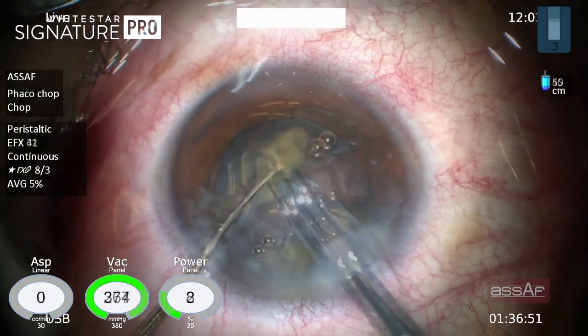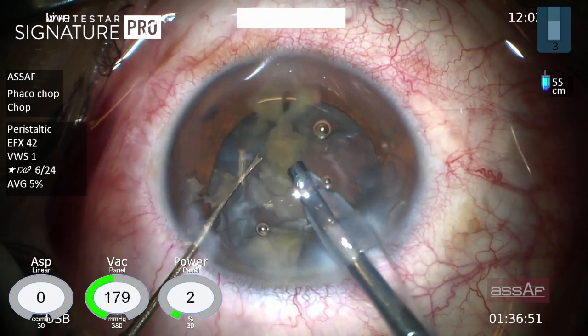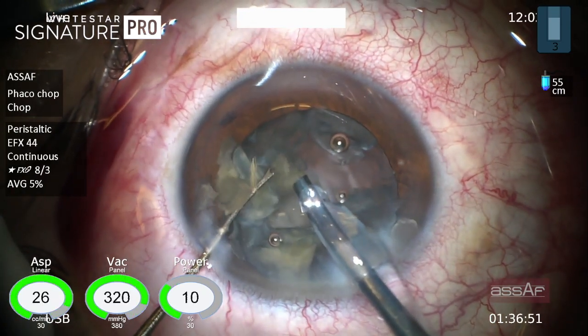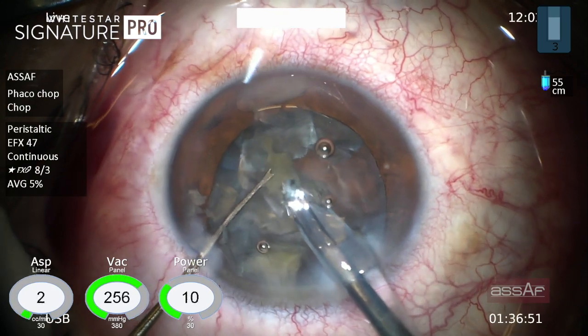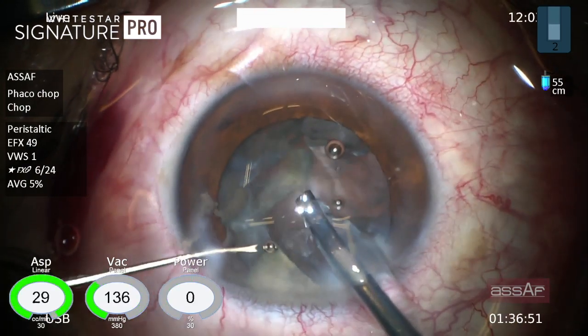Each FACO platform has its own algorithm to guard against post-occlusion surge in the setting of high vacuum. So each surgeon should be acquainted with such settings and play around with the fluidic settings to get the best out of the FACO machine during such unusual cases.